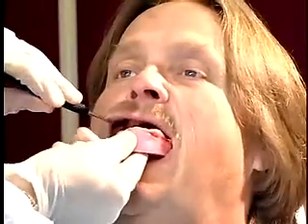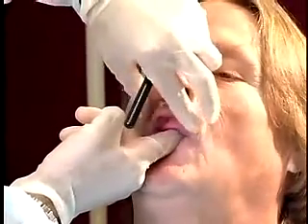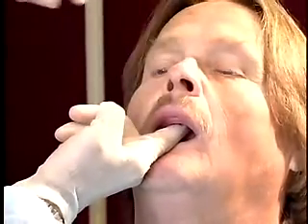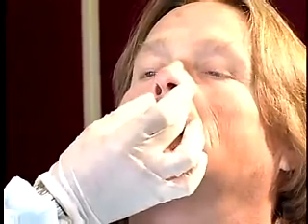Place the maxillary record base in the patient's mouth. Observe the patient's upper lip. Approximately 1 to 2 mm of the wax should be visible in the average patient. Some patients may not show any wax at rest because they have a long upper lip.